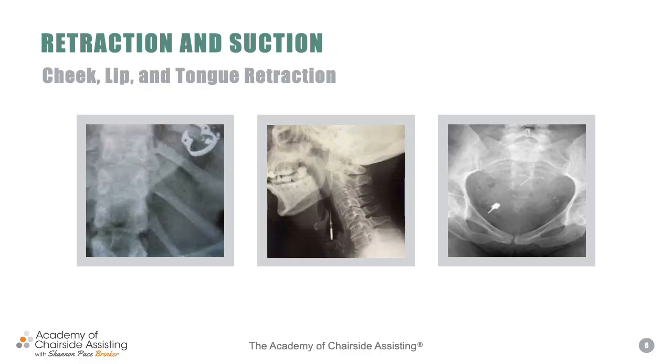But again, if these things happen, one of the things that we have in our charting module are steps for when we have emergencies and what do we do. But most importantly, as a dental assistant, we have to be on our toes and aware. Even if the doctor is working, it is always our job to not only keep the patient's mouth clean, but most importantly, to look out for these little pieces or things that are happening at all times, to really make sure that the patient does not swallow or aspirate any restorative items inside or outside of the oral cavity.